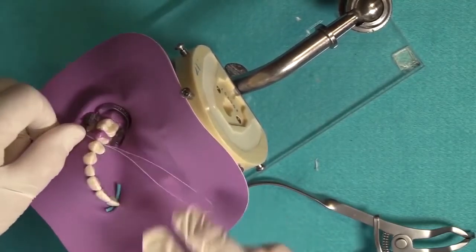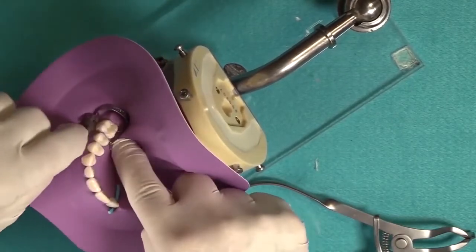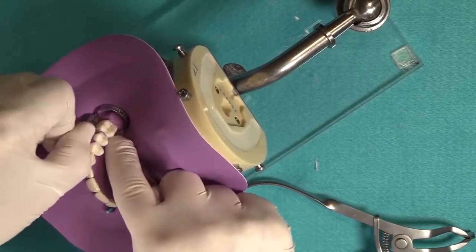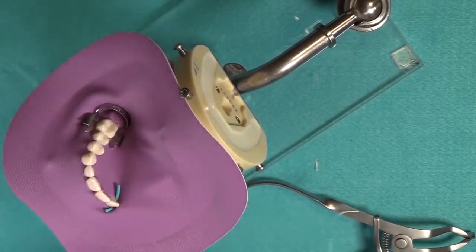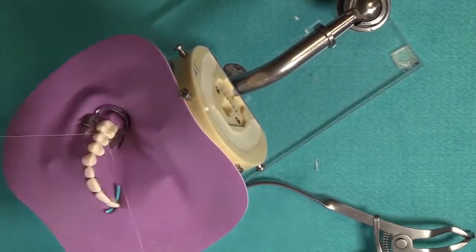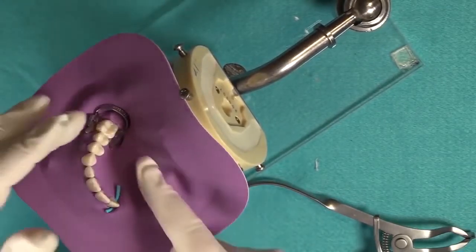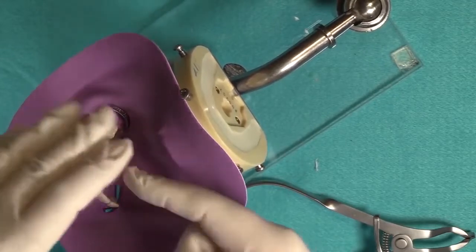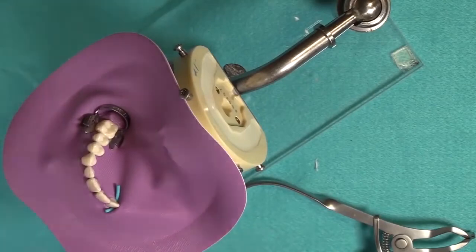So now what would be the most difficult or the most common thing to go wrong? Would it be tearing the material at this point? Yes, exactly. And that's why you want to use the loop technique combined with the knifed edge concept because you're not bunching it, you're actually pulling it in. The floss is carrying that material in for you.